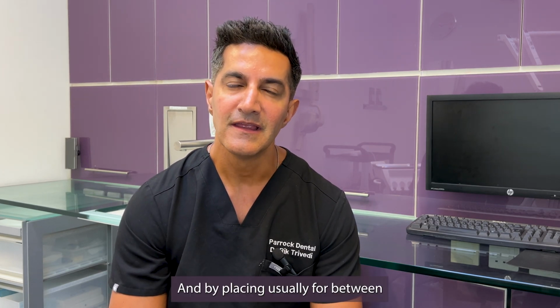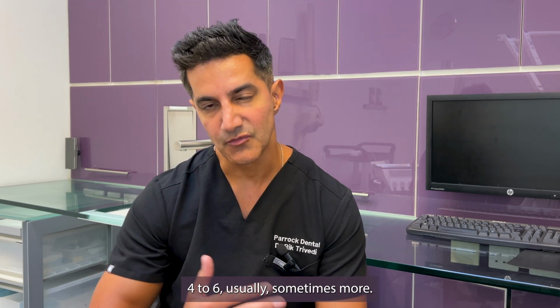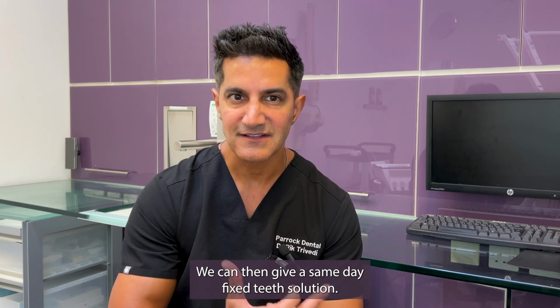And by placing usually between 4 to 6, sometimes more, implants, we can then give a same-day fixed teeth solution.